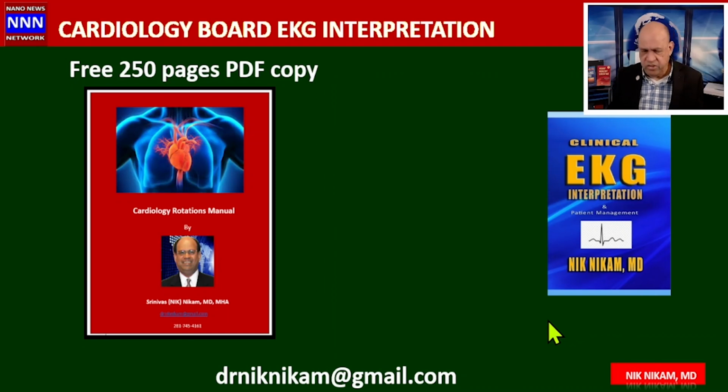So, ladies and gentlemen, this is a very quick summary of ST, T, and U wave abnormalities.